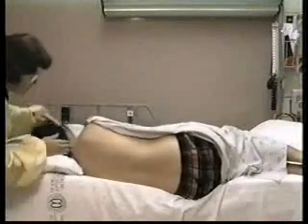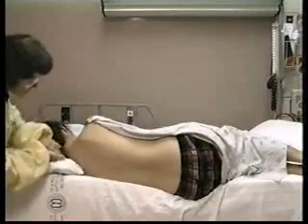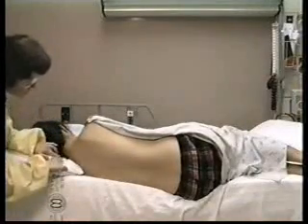Place your patient in the lateral decubitus position with the back close to the edge of the bed. The shoulders and iliac crests should be in perpendicular alignment to the spine. To help with this, put a pillow under the patient's head so that the external occipital protuberance and the spine are in the same horizontal plane.